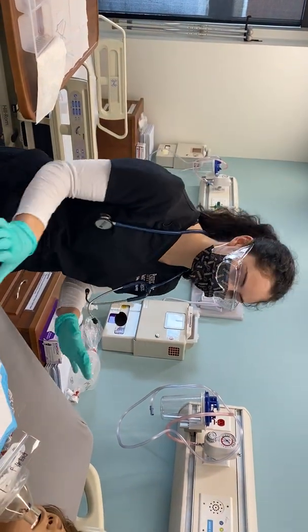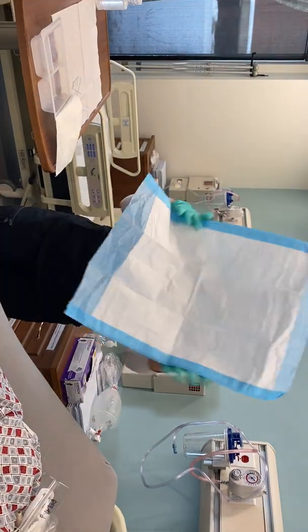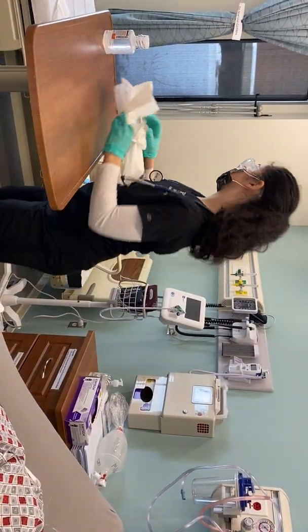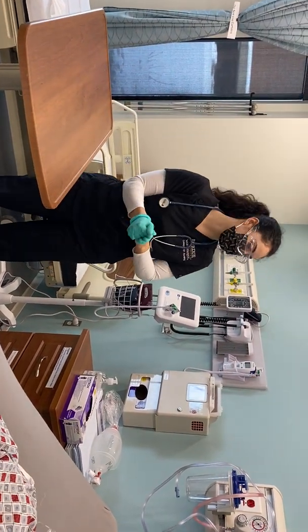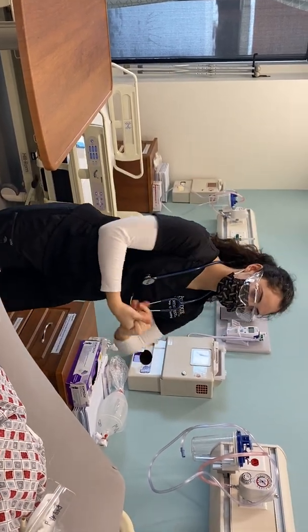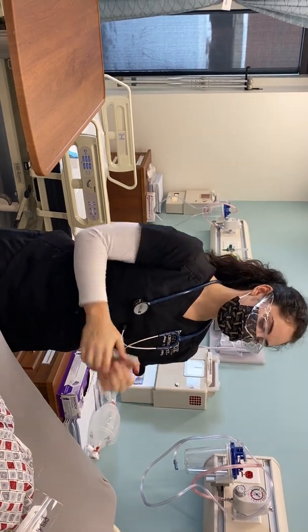All right, so now we're done with that. I'm just going to take this off. Perfect. We're going to discard that, and discard all of this. Procedure is done. I would have discarded that too, or used it for another time. Discarded the gloves. I'm going to do hand hygiene, and then also I'm going to listen to your lung sounds.